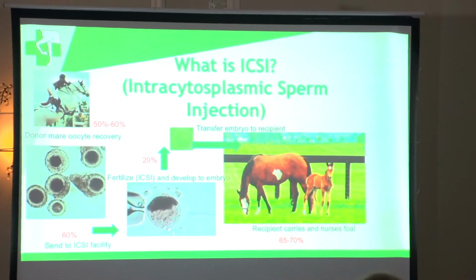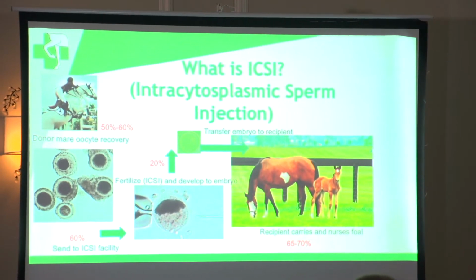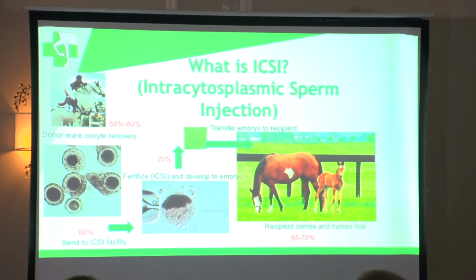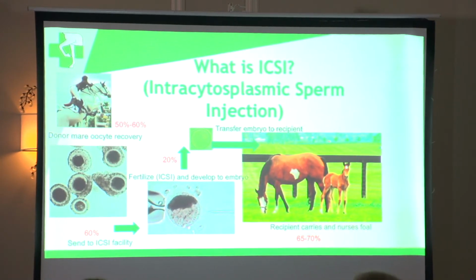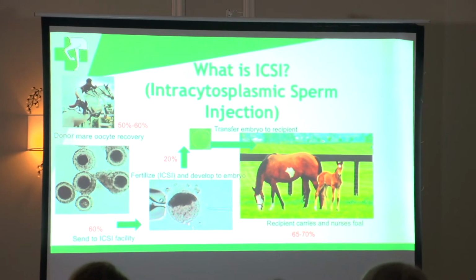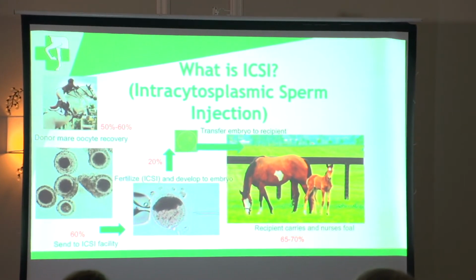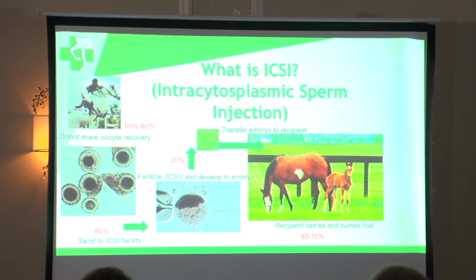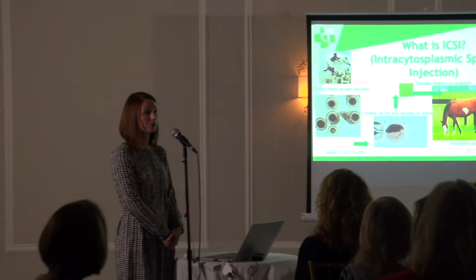So typically we have some percentages up here that kind of go over what our success rates are. And in our typical, let's say, quarter horse mare, she may have 14 follicles on her ovaries. So when we perform the aspiration procedure, we have about a 50 to 60% oocyte recovery rate. So that's maybe about 7 oocytes that we recover from that mare. Those are sent off and placed into maturation media, and of those, about 60% of them will mature. So maybe about 4 of those will actually mature and be able to be injected with one sperm. Of those that are injected and placed back into media, about 20% of them will form an embryo. So our odds aren't very high, but this does allow usually for one embryo per aspiration procedure, but this can and is very mare variable. So age, mare's fertility, and also stallion fertility, the fertility or the quality of the semen is very important in this.